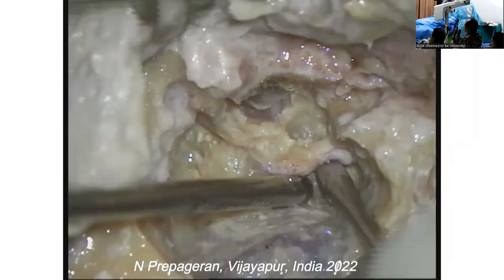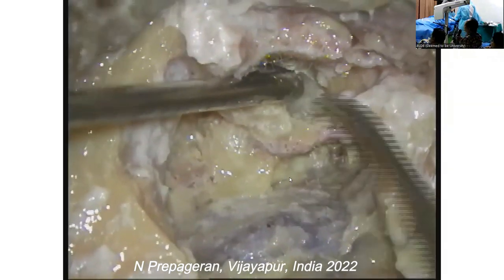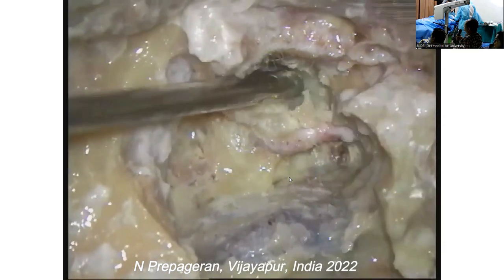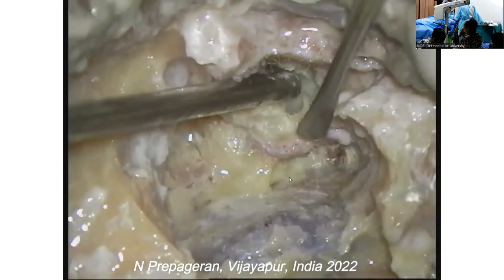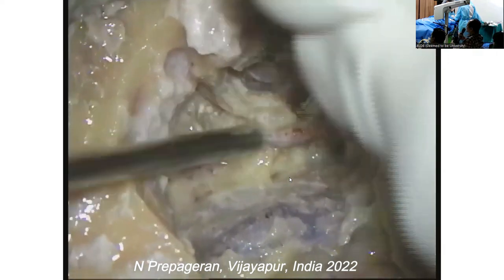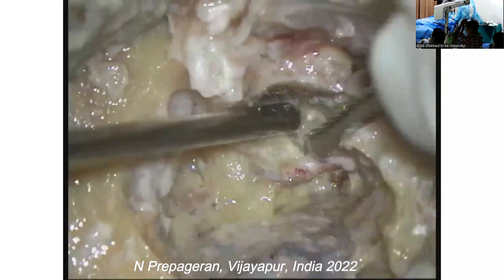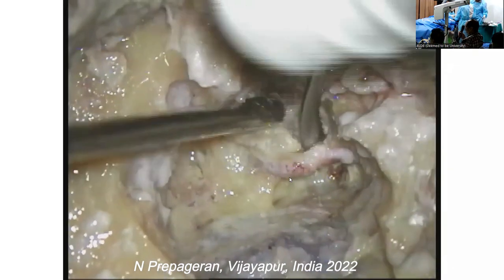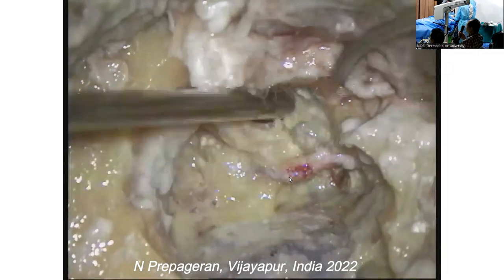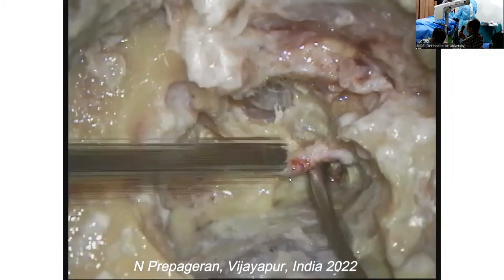So I'm going to go under the facial nerve. Remove this bone from the facial nerve. Can you see the facial nerve is now completely exposed? Yes, sir. And if you go under the facial nerve, you go to the jugular bulb. So the jugular bulb will be under the facial nerve here.